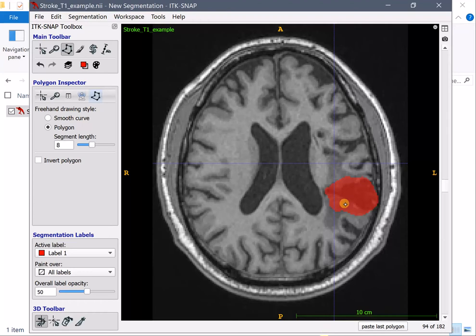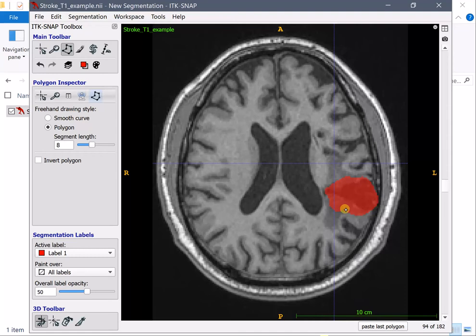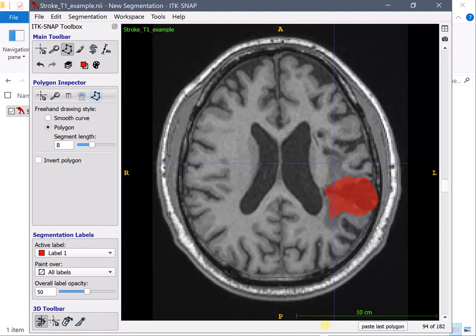Now the exact rules on how to draw lesions are beyond the scope of this video. There is a very nice paper from I believe Cranion 2013 which explains the rules to draw lesions. Typically you may want to get a little more of this darkened white matter edema part or less it depends on how your lab wants to perform it.